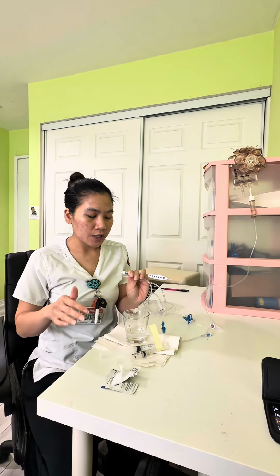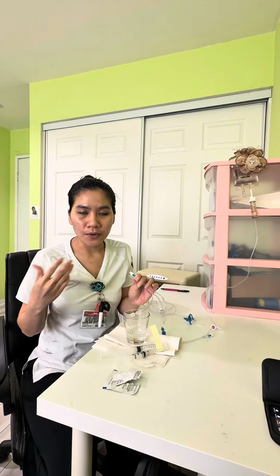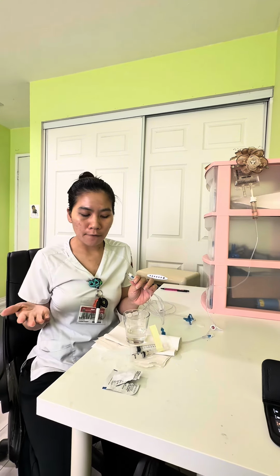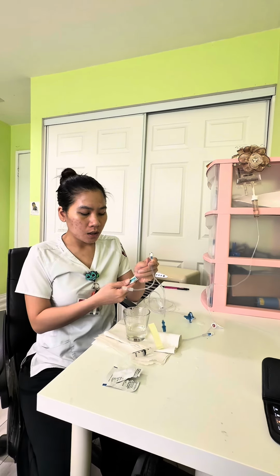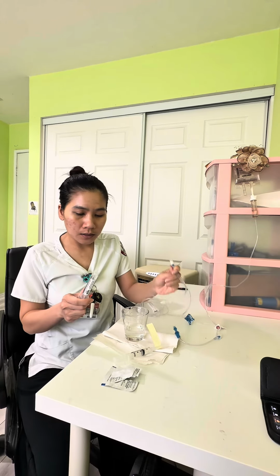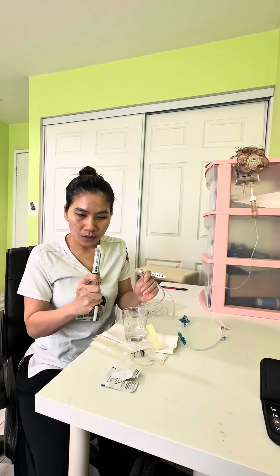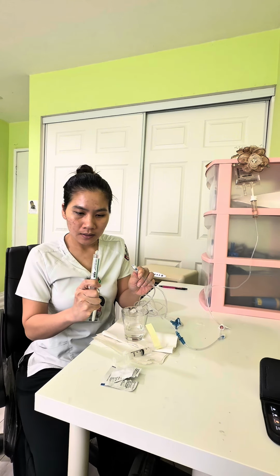Before I administer the medication, I also check the patient's IV site to see any sign of redness, swelling, or discomfort. Since the patient is normal, I go ahead and flush the tube to make sure nothing remains in the tube, since it is incompatible.